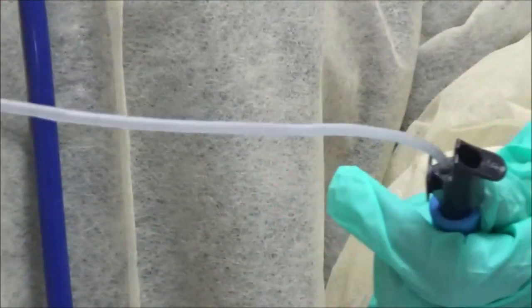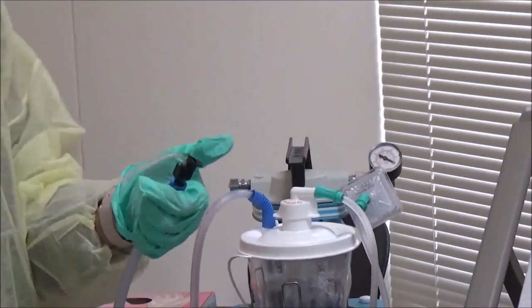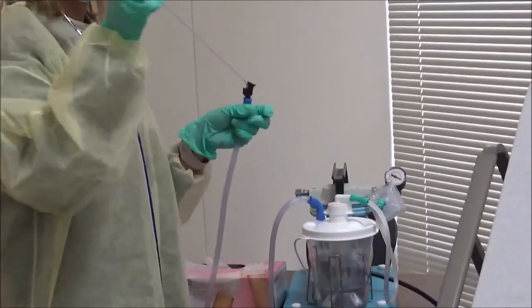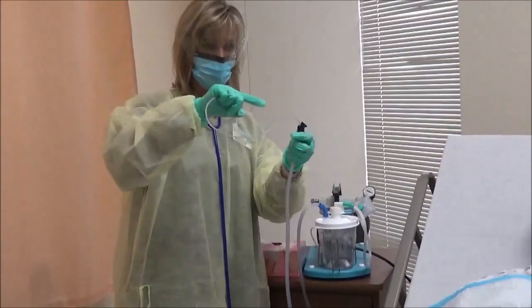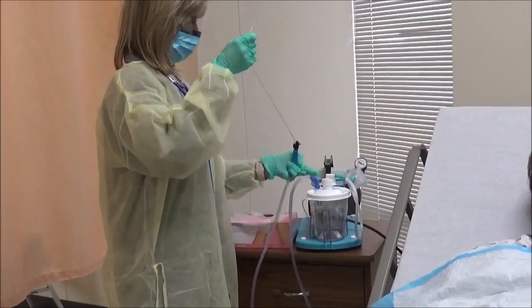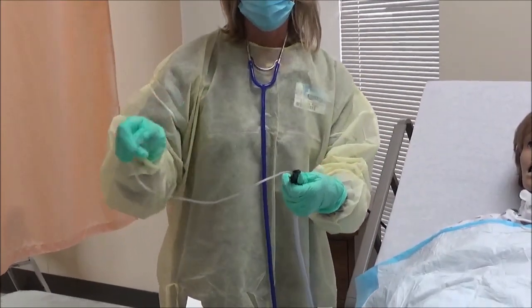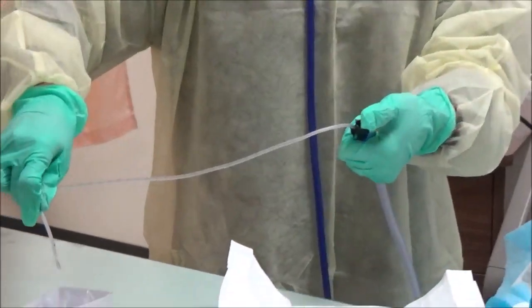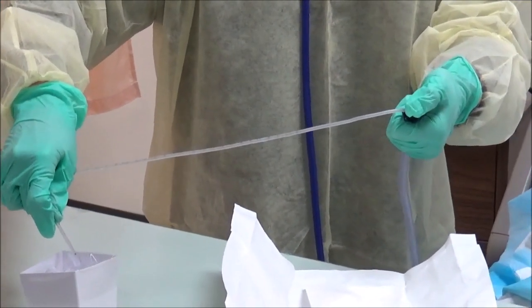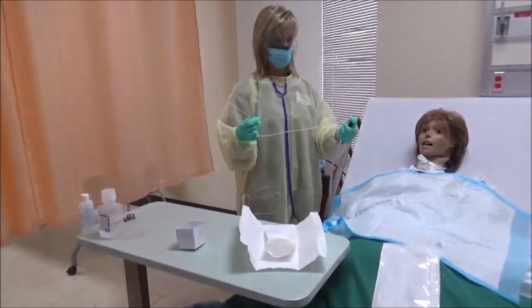I have to test and make sure that everything is going to go through. So I'm going to come here and turn on my suction, and I'm going to test it by putting it in the water. Remember, my left hand is not sterile. Right hand and everything up until this point is sterile, and I want it to stay that way. Now, I'm going to come to my water and occlude the end and allow some water to flow through the catheter. That ensures that it's clean, it's clear, and it's ready for me to suction my client with.